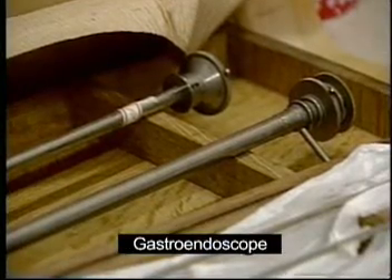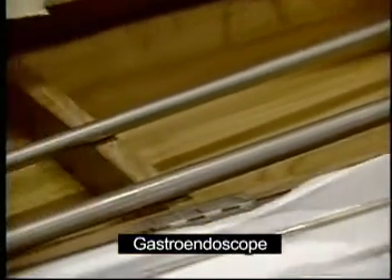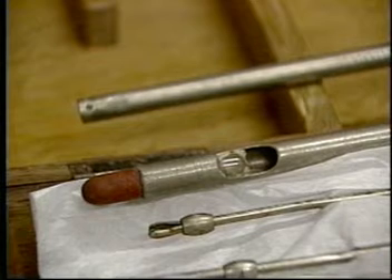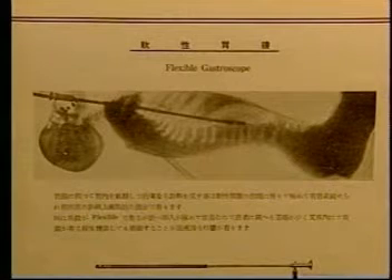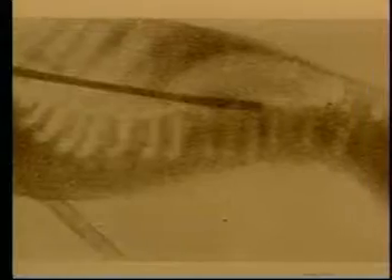The metallic tube, called a gastroendoscope, had an interior mirror and was introduced into the esophagus to look into the stomach, but caused patients enormous pain. The metallic tube could perforate the esophagus and, in some cases, even cause the patient's death. After many accidents, the idea of looking inside the stomach was abandoned worldwide.